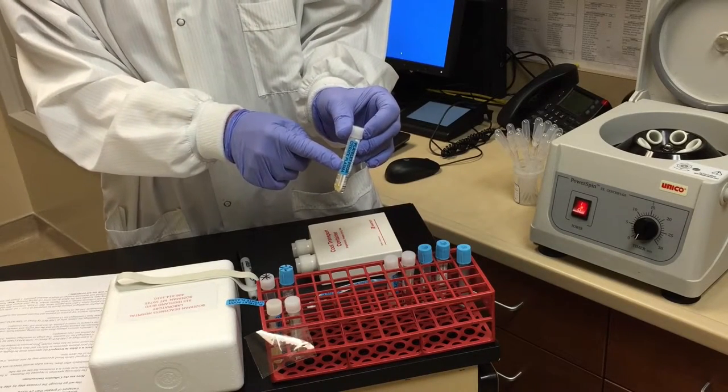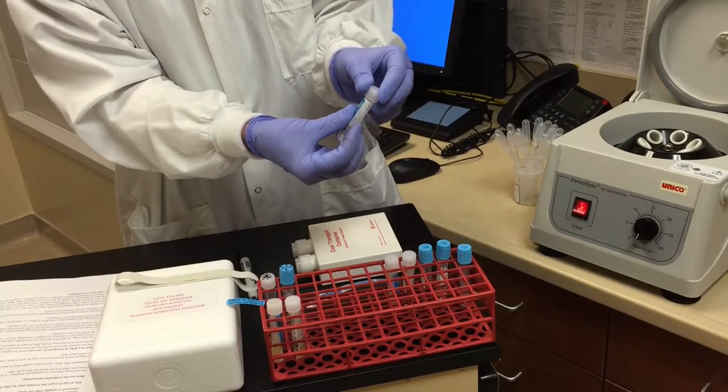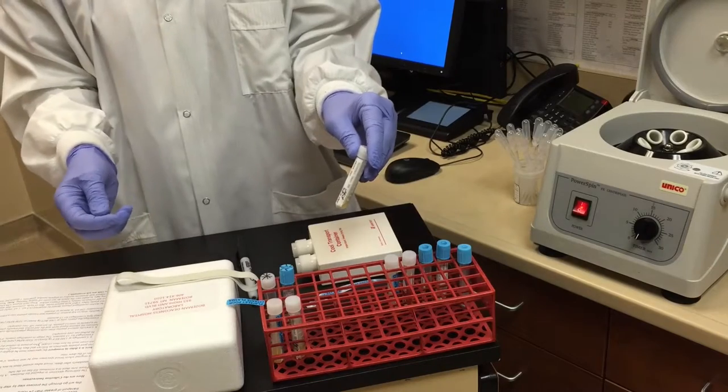You also want to put on a citrated plasma pour sticker that lets us know the specimen type. Then in order to freeze it, wrap the whole label with clear packing tape. This will ensure that the label will stay on during the freezing and thawing process.